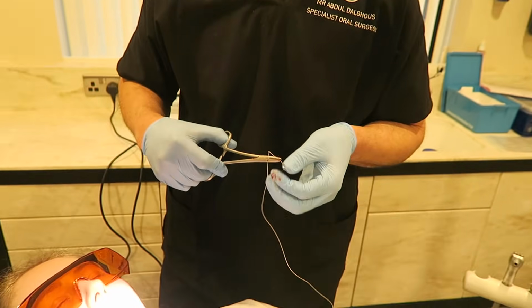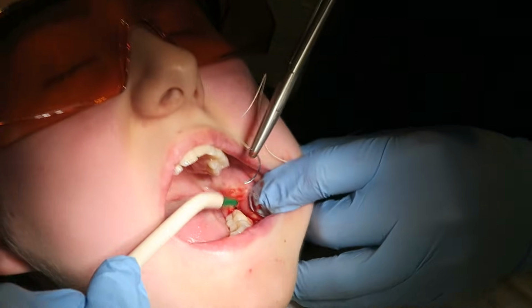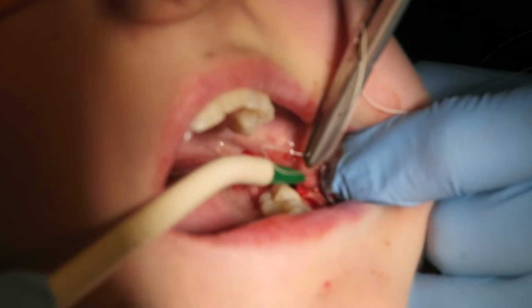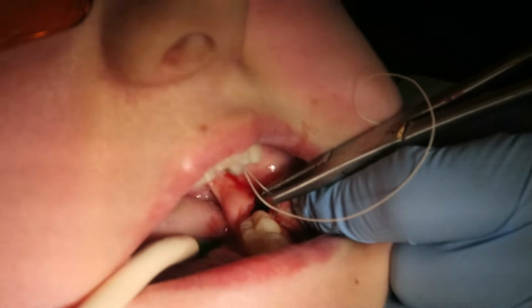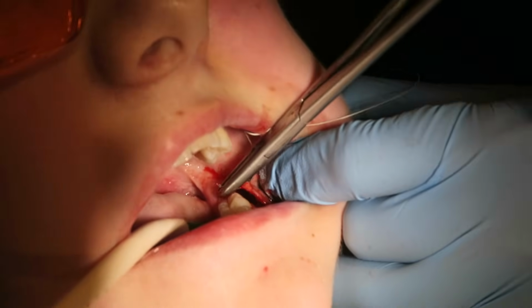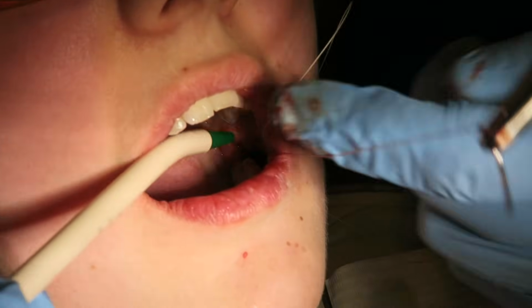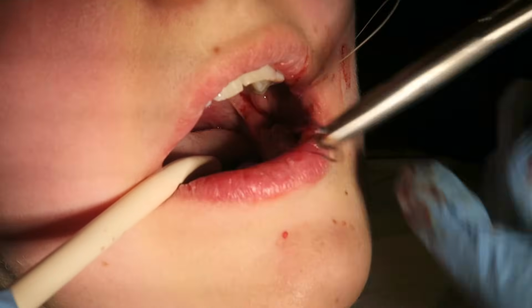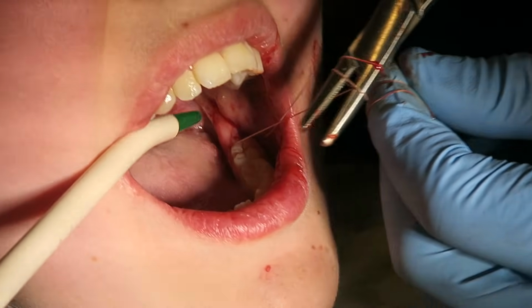I normally use 3/0 Vicryl Rapide. Using a resorbable stitch means you don't have to see the patient again to have the stitches taken out. I use Vicryl Rapide as opposed to Vicryl because it resorbs within a week or 10 days, whereas the normal Vicryl sometimes takes a good 3 to 4 weeks to go away. Obviously, the longer it stays in the patient's mouth, the more discomfort it causes. So I use an interrupted stitch.